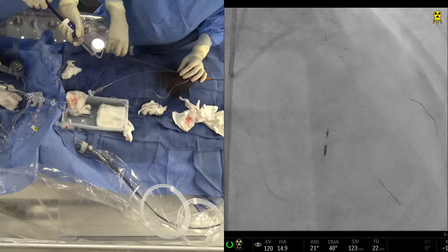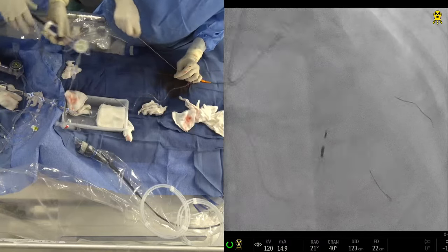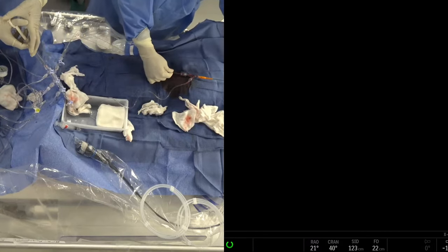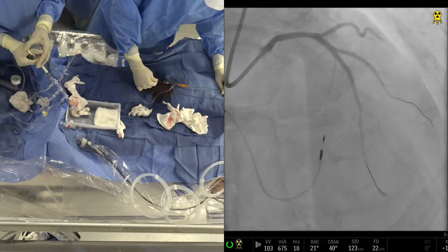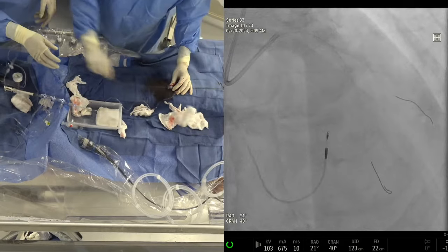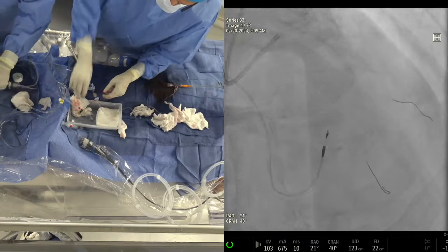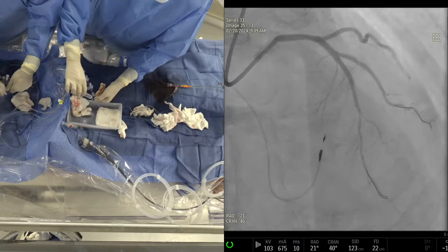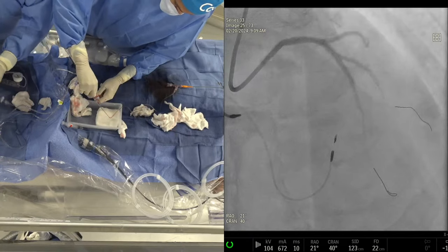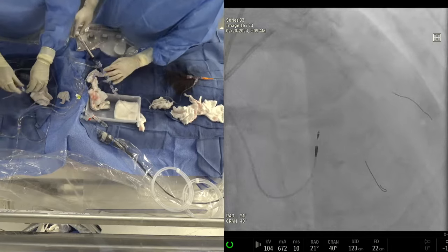Sameen has a question: the need for a POT before recrossing? Yeah, that's a very good point. So the question is POT versus no POT, and the paper will be coming out this week. We have done it; POT is indicated in left main, everywhere else it is just done without any clinical evidence. The title is: POT is common practice without any clinical data to support it. So in the non-left main, our recommendation is no POT. Just do the kissing balloon, which is good enough.